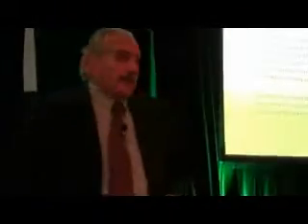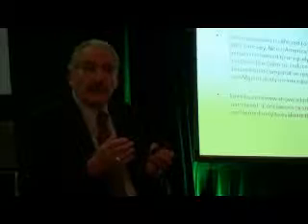It supposedly reduces intrinsic muscle spasms in the sales literature, but there are no published studies indicating that's a fact, no controlled studies, no large-scale studies showing any proof whatsoever that reducing the muscle spasm lowers intradiscal pressure. There's no relationship in the literature for that.